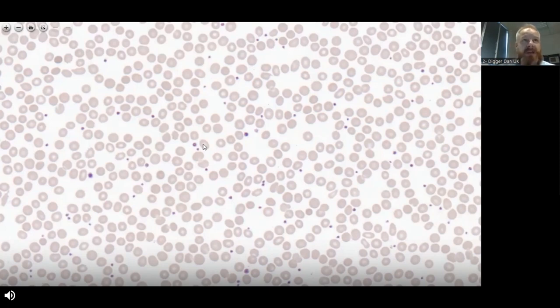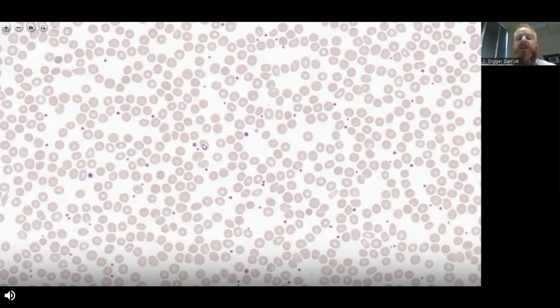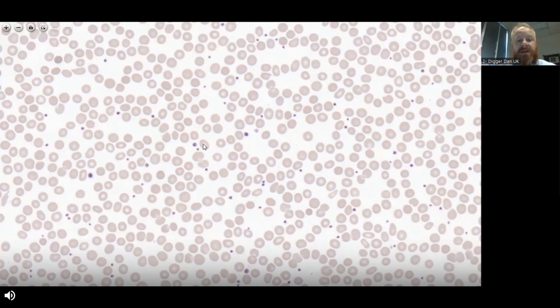Even in a normal healthy person there will always be a small variation in platelet size. About five or six percent of platelets can be four or even five micrometers in diameter, but that's probably the limit. Any more than that, we might be looking at a platelet pathology. We have to be very wary of that and therefore approach our blood film in the standard manner, including all considerations for platelet numbers and platelet appearance.